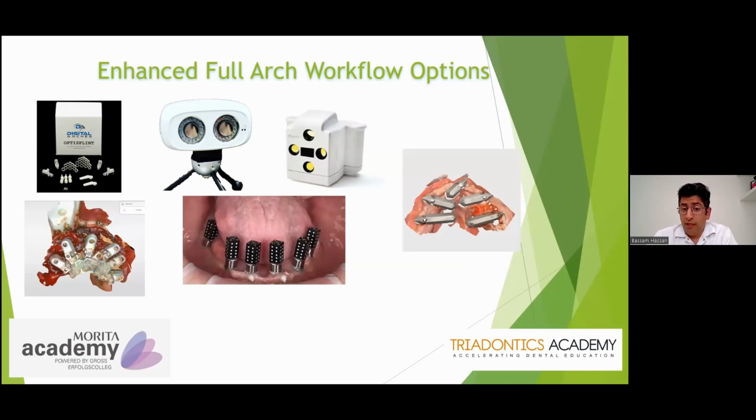I mean, the future will tell in which direction the industry will go forward. But I'm really quite excited to be able to do most of the cases using just my intraoral scanner. And in some cases, I would need to acquire something more, like extraoral scanning or an OptiSplint solution.